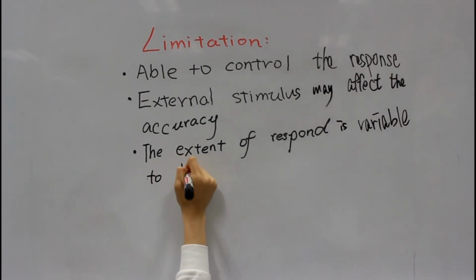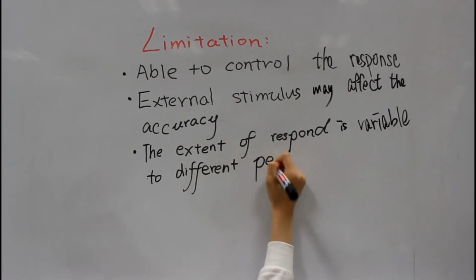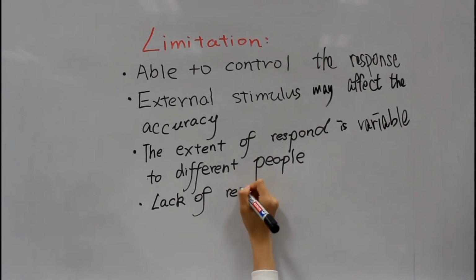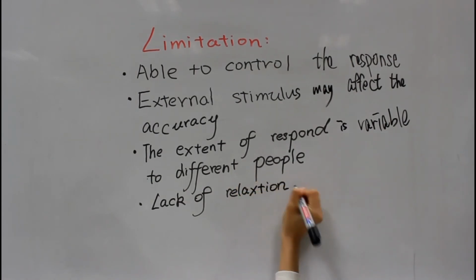Last but not least, in a noisy environment, such as a lab room full of students, the subject will not be able to relax enough to have a polygraph test, since the subject may find things interesting and cannot focus on the test.